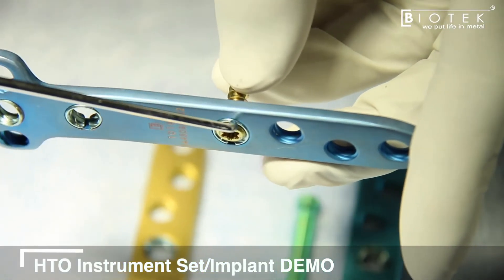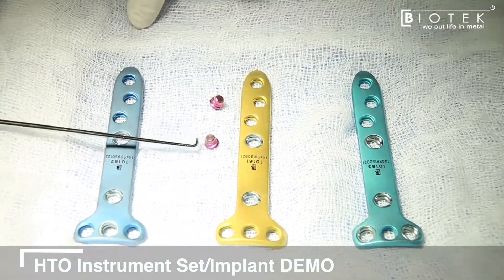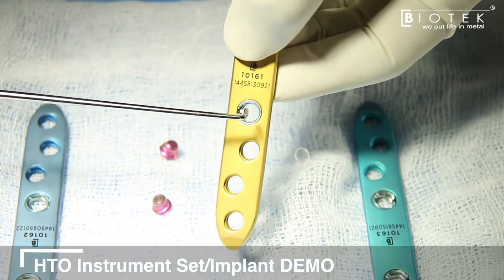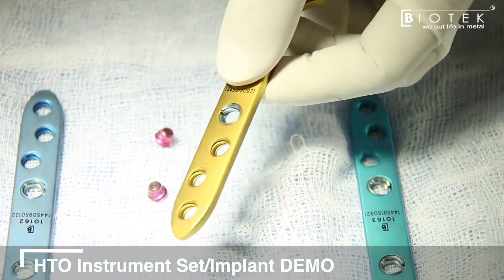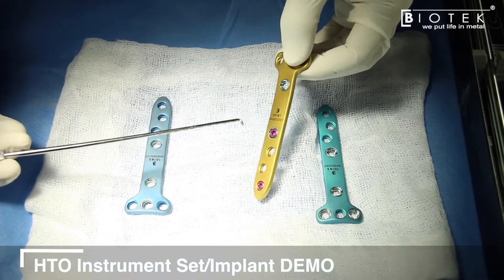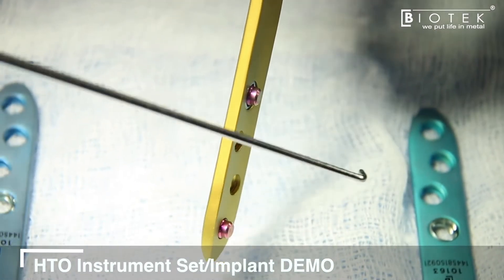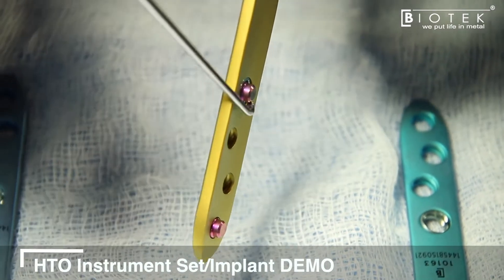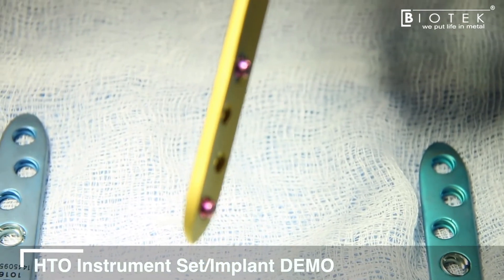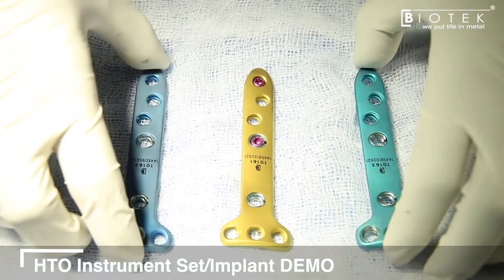With each plate, spacers are also provided, prefixed in hole number one and hole number four. Once inserted, these spacers prevent the plate from compressing to the bone, leaving ample space for the pes to glide freely if the surgeon decides not to take off the pes during the high tibial osteotomy.